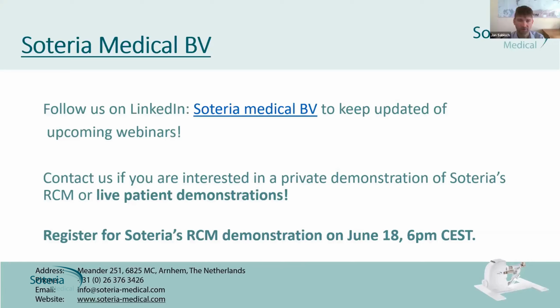Maybe from our perspective, with experience of different users in different markets, all the patients have definitely received a diagnostic MRI, so there shouldn't be any contraindications to MR in general. And a lot of them also have received previous ultrasound biopsies. So there shouldn't be any contraindications for those patients, but those would be similar in those two settings, I believe.